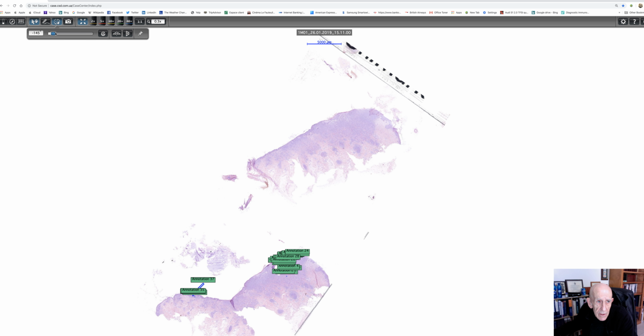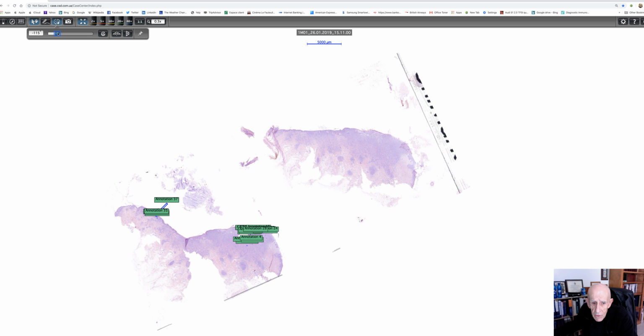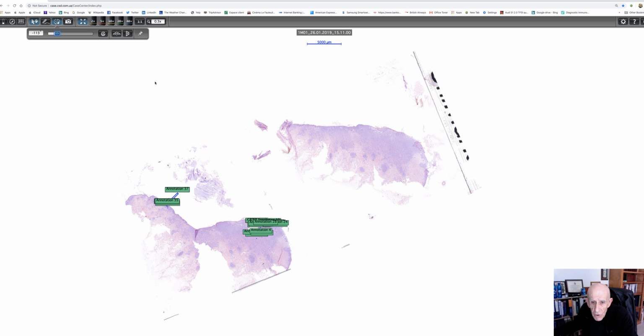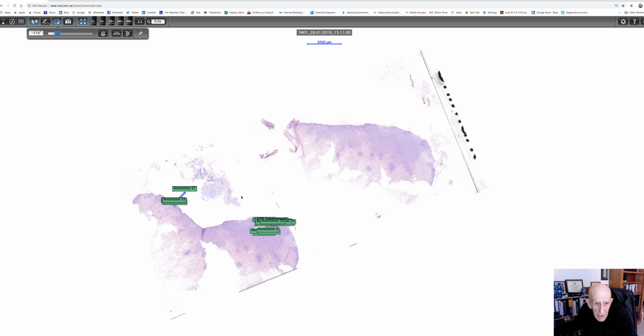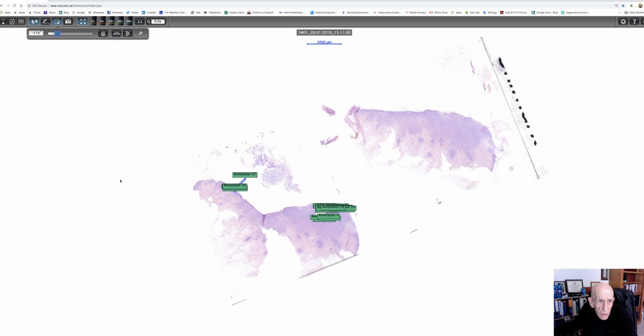And I'll just straighten this slightly, and we can see that there's a tumor which is very close to the epidermis. I don't know whether it's arising there yet or not, and it is extending deeply into the dermis, almost to the level of subcutaneous fat. So if we combine that low power view and Antonina's annotations, I think we can have a pretty good idea that this is not going to be a good news tumor.